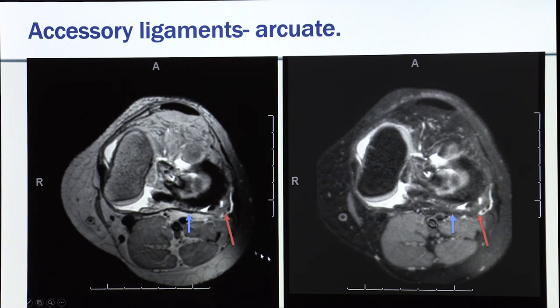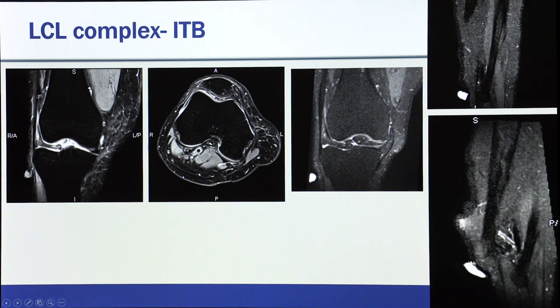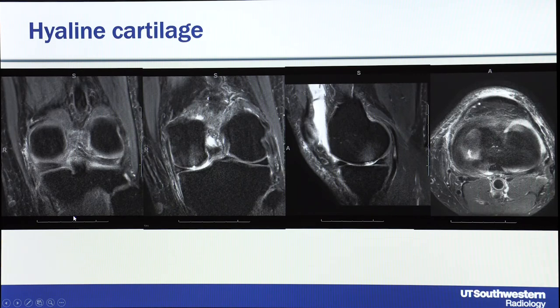For structures like the iliotibial band, they are easy to see on 2D images but hard to appreciate any abnormality. On 3D images the IT band looks quite thick, and here is the fibular collateral ligament behind it and the iliotibial band in front — broad and thick. This was a case of iliotibial friction syndrome with the patient's pain marker correlating to that area, pretty nicely seen on 3D images.